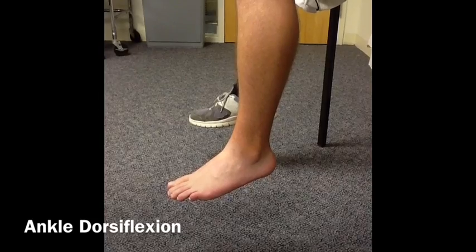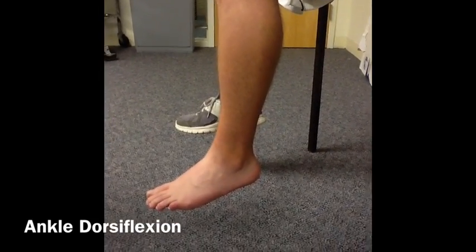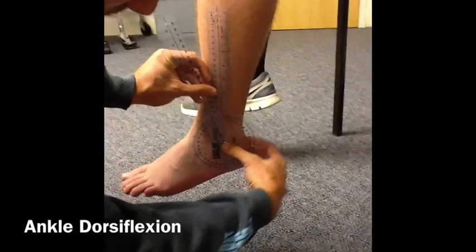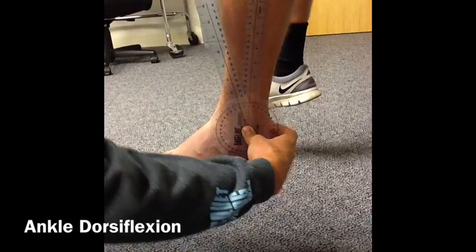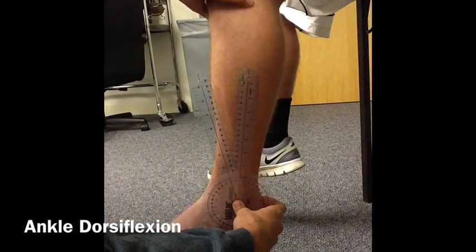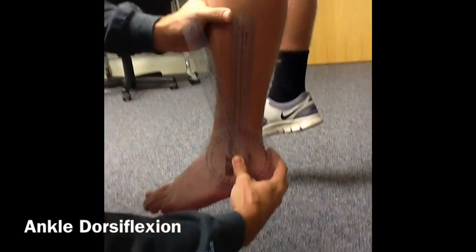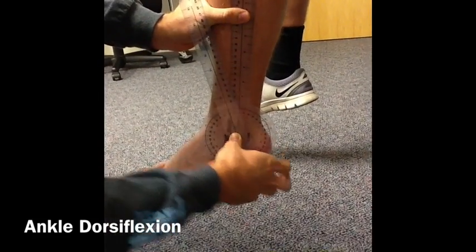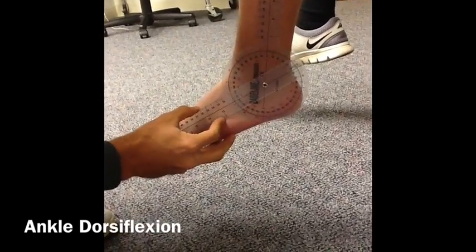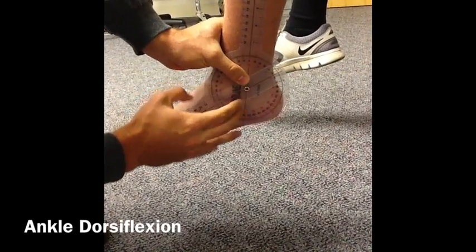To position the goniometer, place the fulcrum aligned with the lateral malleolus. The stationary arm should be aligned with the midline of the lower leg using the head of the fibula as a reference. The moving arm should be aligned with the fifth metatarsal. Be sure to line up the patient's foot at 90 degrees to begin.